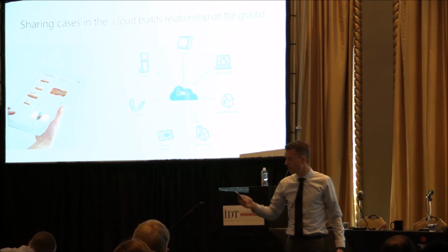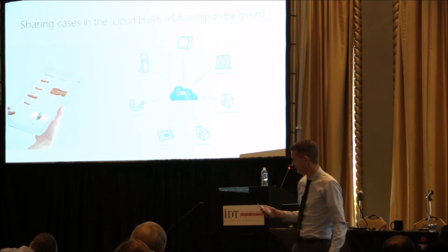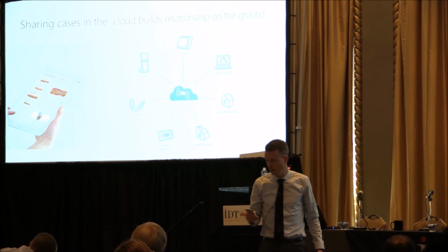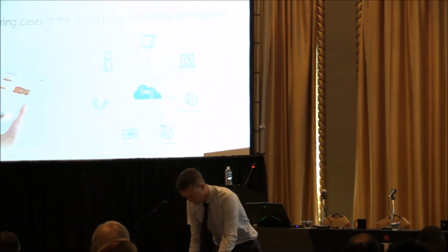All right, so what you can do here is you have the app. You can basically load the 3D scan, so here's a case. And in 2 seconds, I'll send it around here. You can basically sit here and look at the scan and the design case. Here we go, send it around. Don't call my boss, okay?